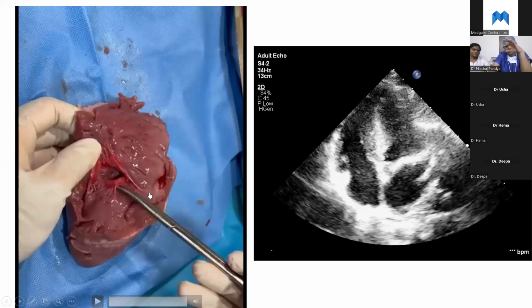When we see a double chamber right ventricle, this gets shifted more at this point. So it's more in the center itself, and we still see an ostium, but it's closer to the papillary muscle that comes off from the TSM somewhere here. So we are seeing a thickening over here, somewhere at the midpoint of the VSD level, not so far off.